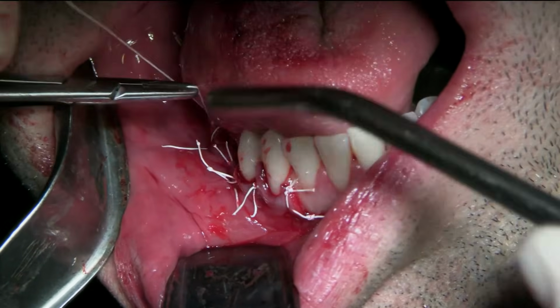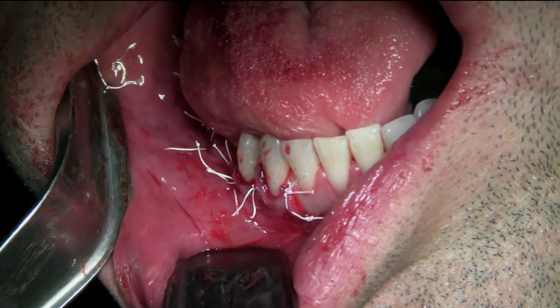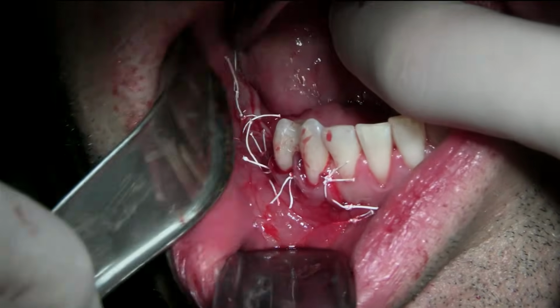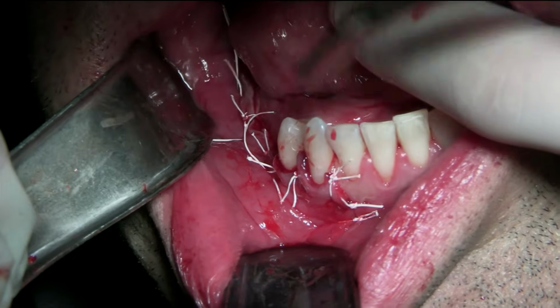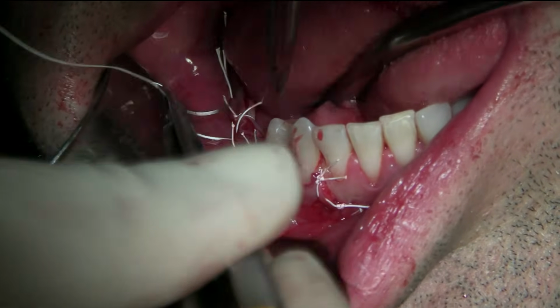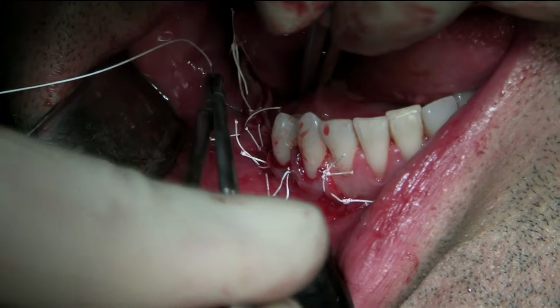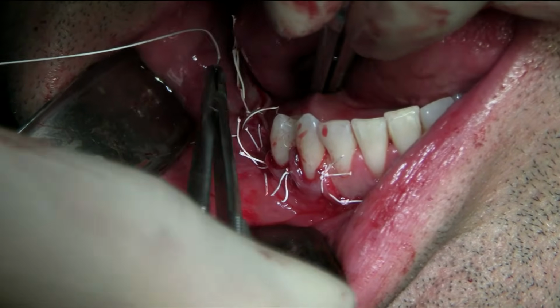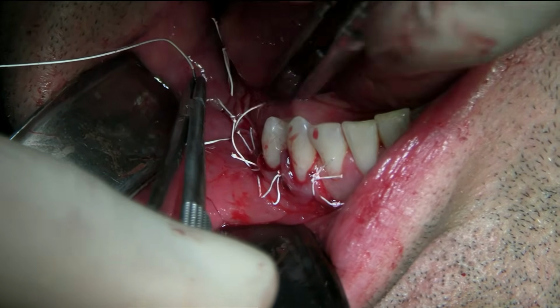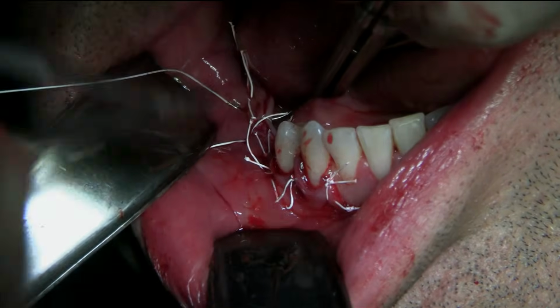And it's important to recognize that these membranes can stay exposed safely for about 30 days, sometimes longer, but 30 days is a safe one. You can say 30 to 45 days. And then you have to go back in and remove them, and obviously you also have to remove the pins and everything. So it's a surgical step that we don't do unless there's a surgical complication.